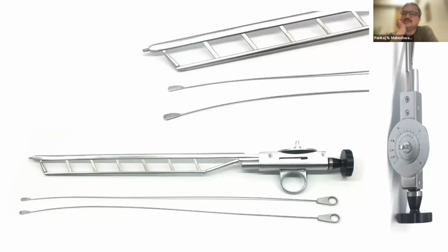So what is the mechanism of action? Means what exactly does this do? It dilates the urethra, sir. It helps in accommodating the sheath before doing a transurethral resection of prostate, sir.